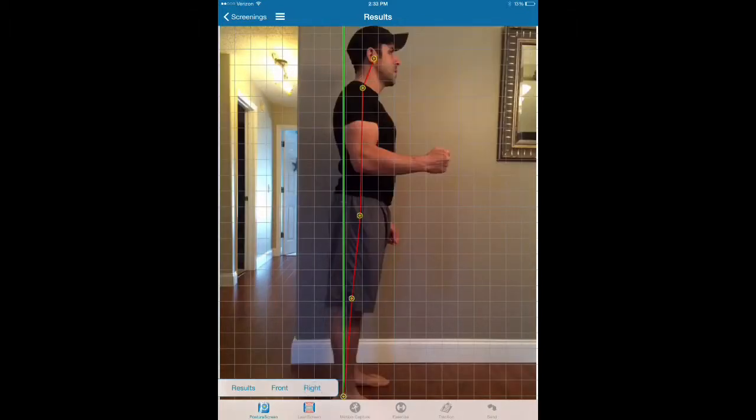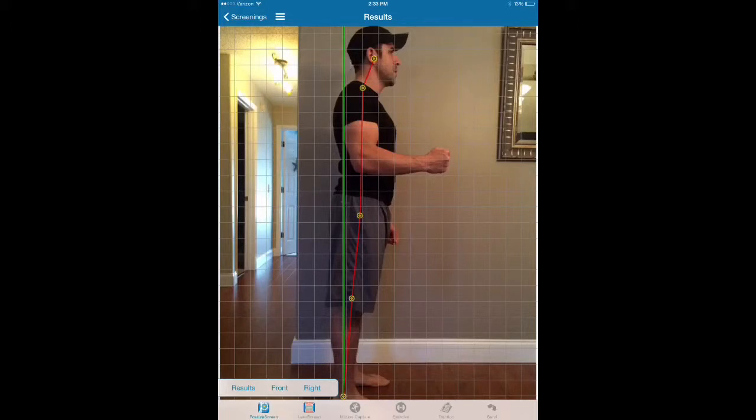So for instance, this displacement on the lateral view is relative to the point below. It's not relative to the distance back to the plumb line, which is generated by the ankle.